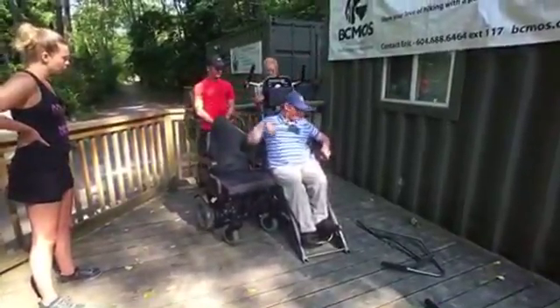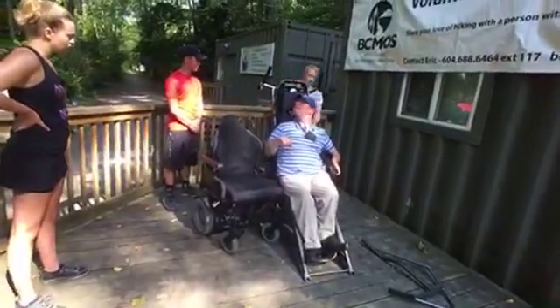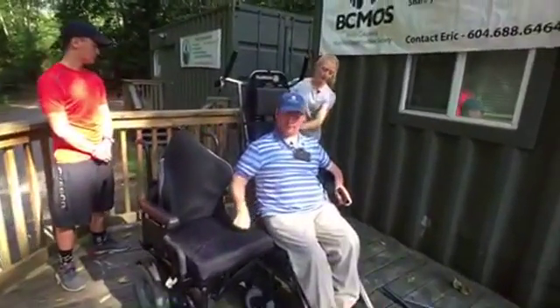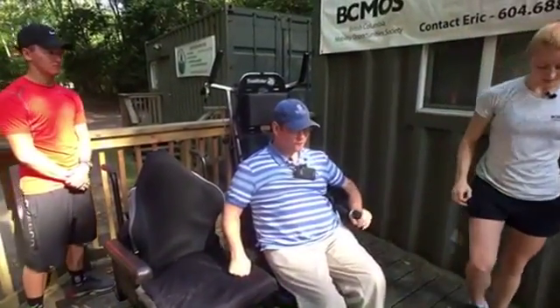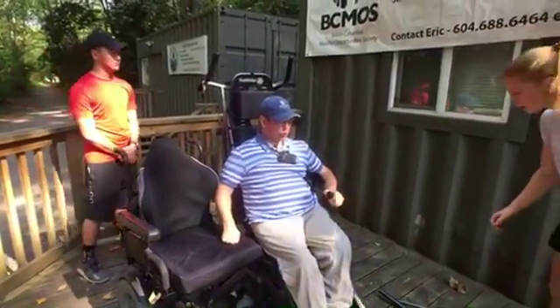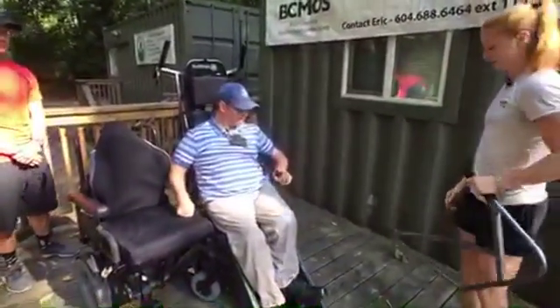All right, so we just recline. We can recline the backrest here with these two knobs. And Eric, once we put the front forks on, you'll tilt back a little bit as well. So yeah, it'll help make it more comfortable. But right now I feel pretty safe and secure. I know I got my legs underneath me.